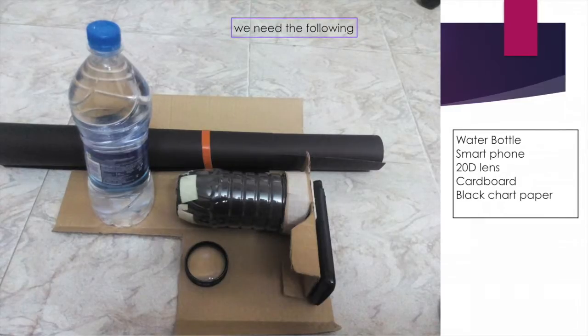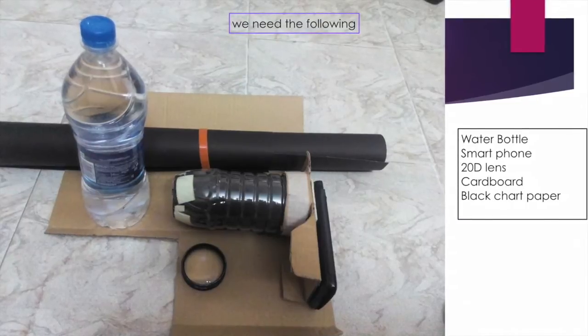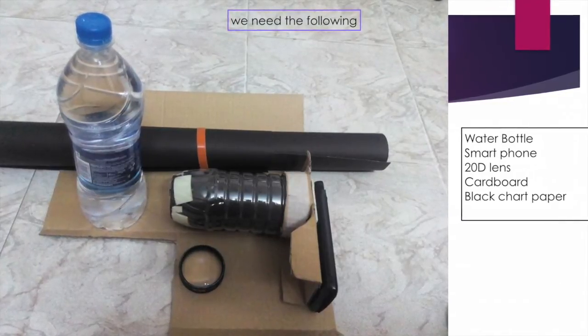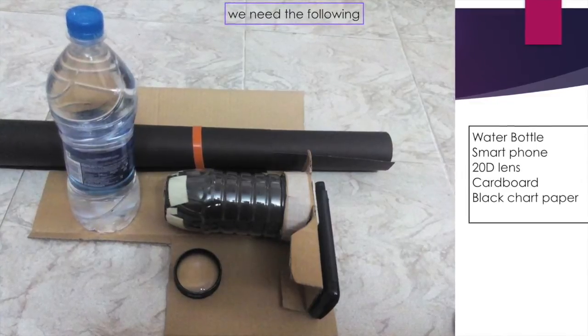All you need is a water bottle, your smartphone, a 20D lens, some cardboard, a black chart paper — and that's how the assembled unit looks.